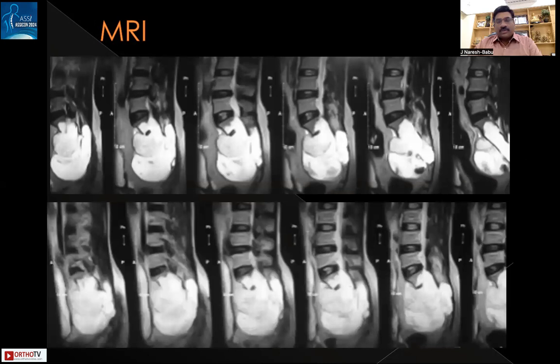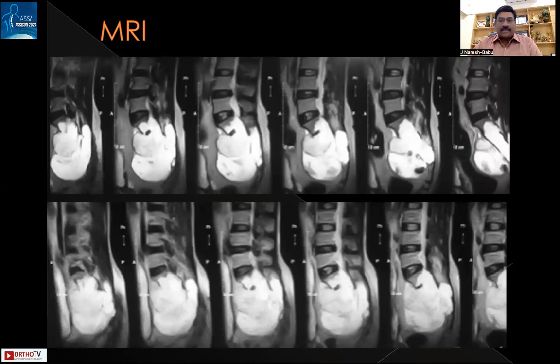MRI of the same patient in sagittal sections shows a huge hyperintense lesion arising from S1 and completely encroaching onto the distal sacral segments. There is a breach in the cortex — the posterior elements have been breached with infiltration into the soft tissue both anteriorly and posteriorly, and it appears to be pushing the rectum anteriorly.